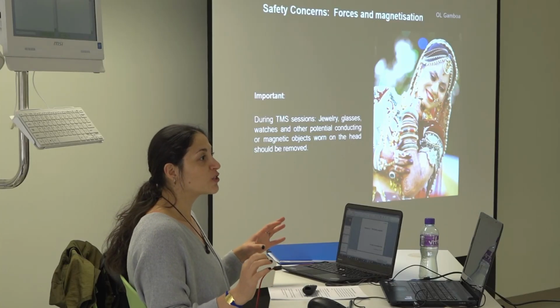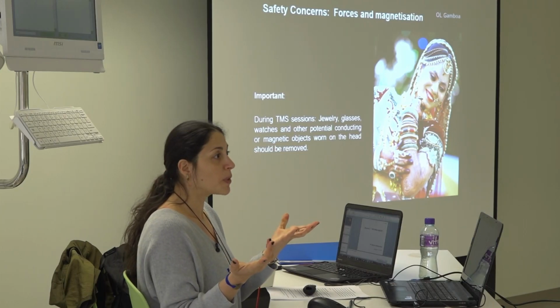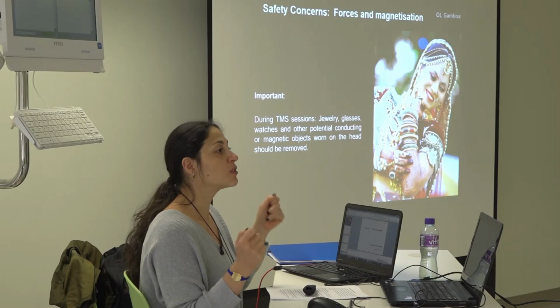Just because the logic says that you are far enough, don't do it. Because if the rules are there, it's for something. And this is very common, because you will measure a lot of young people, and a lot of young people now have a lot of piercings, and some of these cannot be removed, or they need to be removed in a special place. Ask them to remove them. If they cannot remove it, just don't measure.